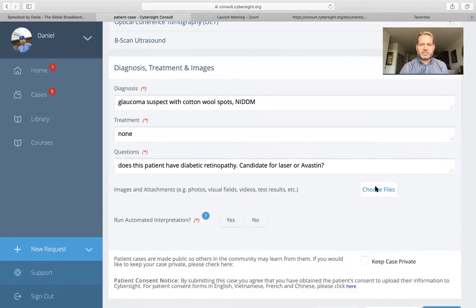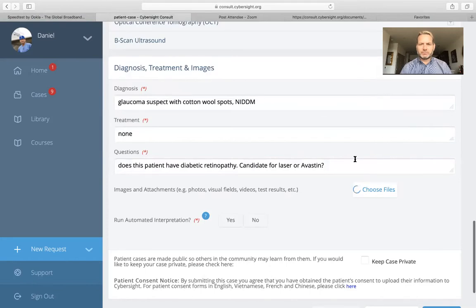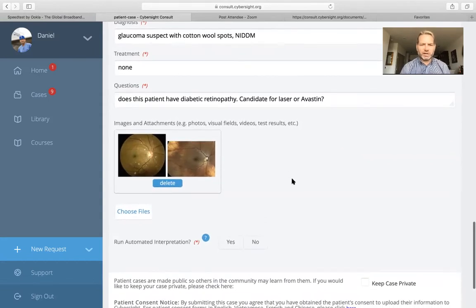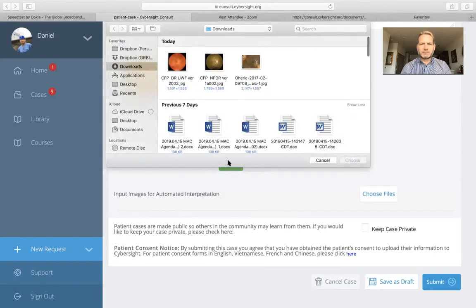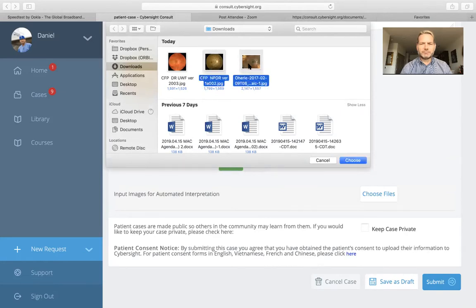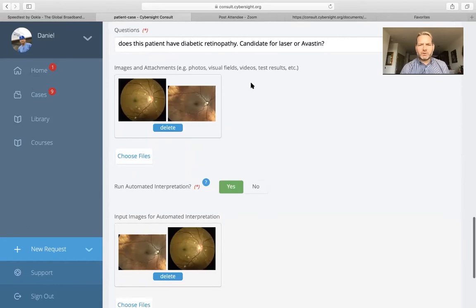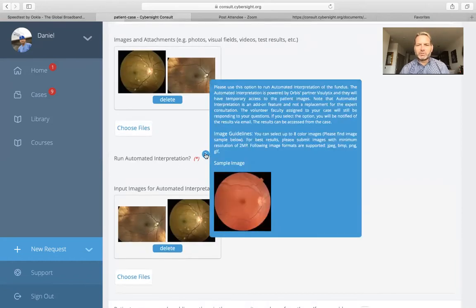Normally, this is where we would be attaching our standard photographs. If you hold down the command button, you can select multiples and upload those. But because this is a retina or glaucoma case, we can also look here for 'Run automated interpretation' — this is the Visualytics artificial intelligence interpretation. I'll select yes, and add a couple of photographs. For the Visualytics AI software, you're restricted to fundus photographs: JPEG, bitmap, PNG, and GIF files can all be submitted, but these must be photographs of the retina or photographs of the optic nerve.